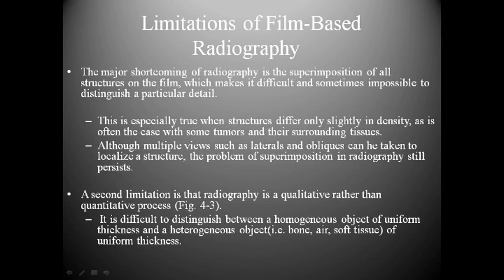As we know, based on looking at just conventional radiography, there are several limitations of it. And because of these limitations, we have to compensate. First, it was compensating by using different methods to acquire images, and now it has become basically the standard protocol that CT has kind of filled in the gaps for when we cannot see things on conventional radiography. So the first thing that we have to worry about with conventional radiography is quite simple. The first thing is superimposition.